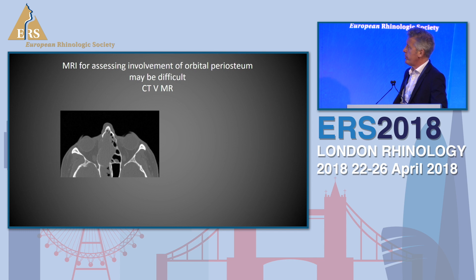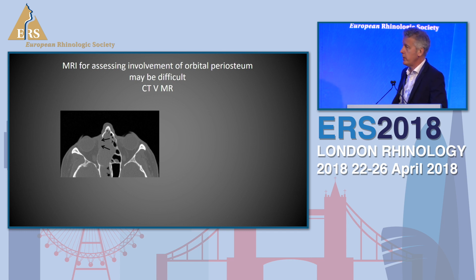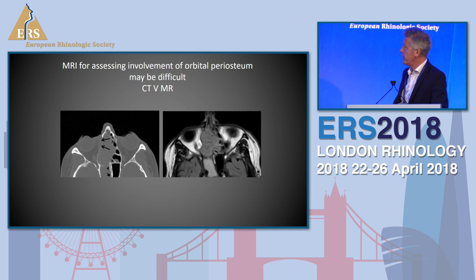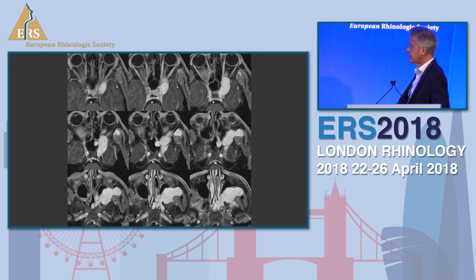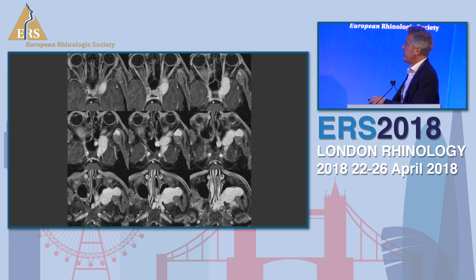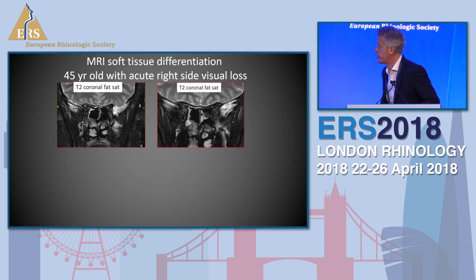What is also well known is the advantage of MRI over CT for assessing a nasal mass. You can see on this nasal mass that the medial wall of the orbit is eroded, but is the periosteum intact? If you look at the MRI, you can see there's still a dark line of the periosteum intact. Here's another patient showing the quality you can get with an angiofibroma post gadolinium - you've got extensive extension to the cavernous sinus along the orbital fissure and pterygopalatine fossa, and you get beautiful imaging.